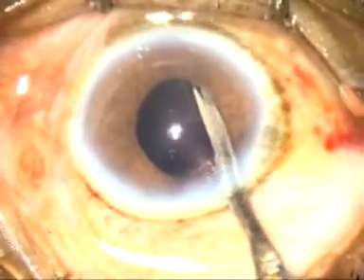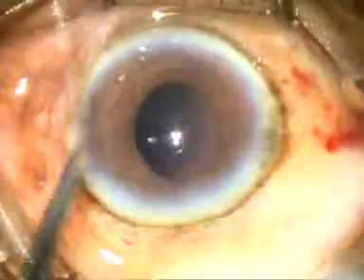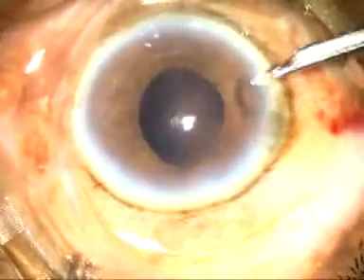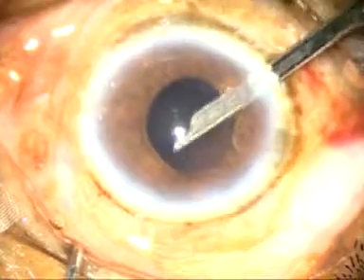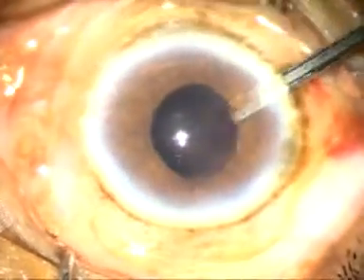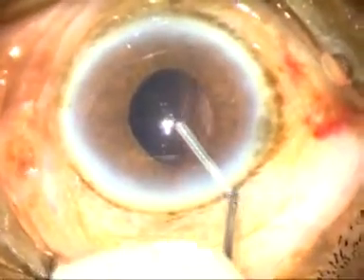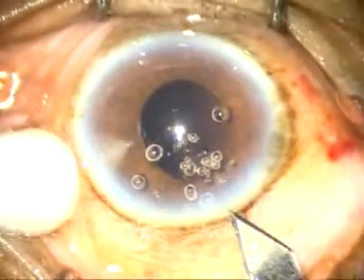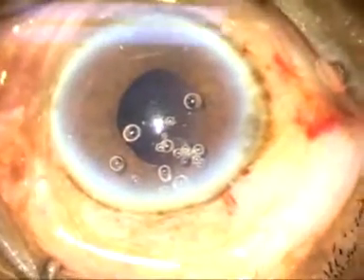How to remove the cortical matter: you can't see the cortex, but with experience and a sweeping motion, we can catch the cortex and remove it. The viscoelastic substance is being used and since the pupil is small, I want to place the capsular lens in the bag. I am enlarging the incision to about 3 mm so that the tip of the cartridge goes into the anterior chamber and I can nicely place the lens in the bag.